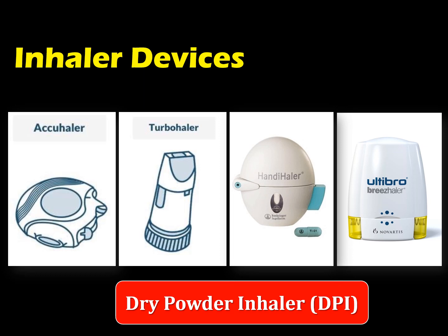So what are the advantages of using these dry powder inhalers? They're breath actuated, so it's dependent on the patient. A spacer is not necessary. Priming is not necessary as compared to your MDI. And there's no need to hold your breath after inhalation for prolonged periods of time. It's also portable. However, the problem with DPIs is that they require adequate inspiratory flow for the medication to be delivered into the lungs, and they can result in high pharyngeal deposition, and humidity can potentially cause the powder to clump and reduce the dispersal of the medication.